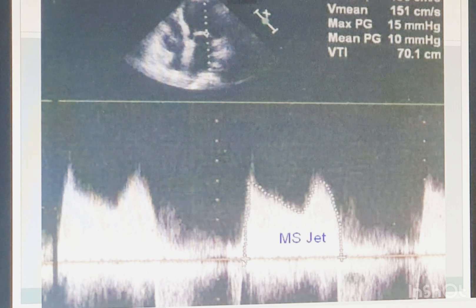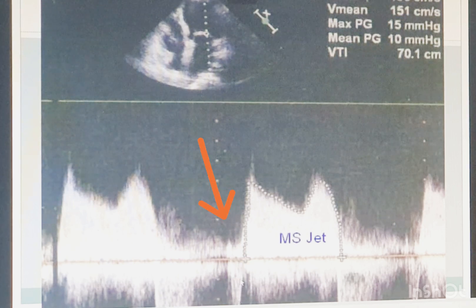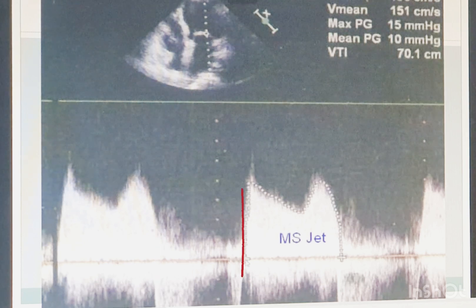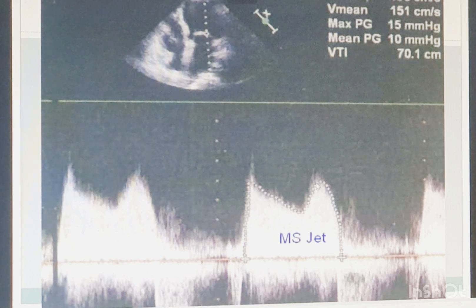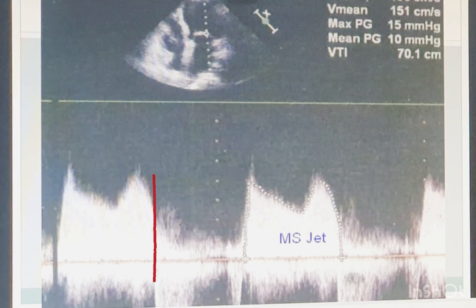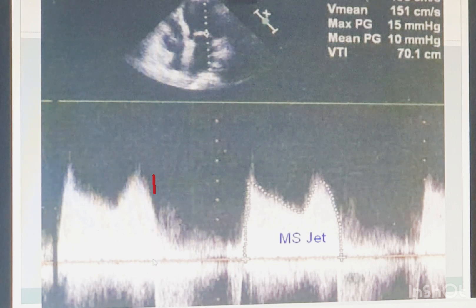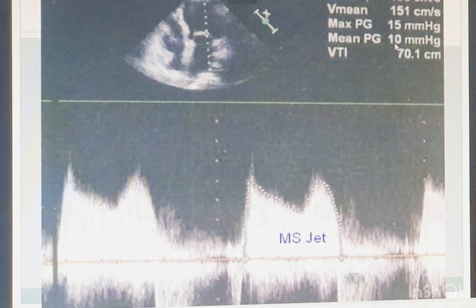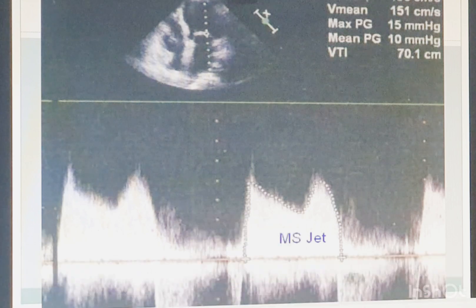Here on the slide you can see the MS jet. The measurement starts from where the signal is dense — not from the hairy edge. We know the MR signal starts here and finishes here, so you start tracing after the MR signal and don't include those hairy parts. Trace the full signal and stop here. You can also use PW, which shuts off where the mitral valve closes. This gives you the peak gradient and mean gradient.